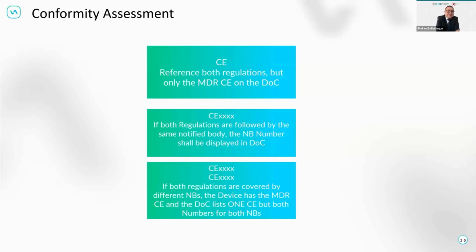Else you will run into the duplicated CE, which will not be possible, because with that one you are not able to get a free sale certificate, because it's currently just not doable. It's technically not doable to get a free sale certificate for your product with 2 different CE marks, and it's also not possible to register the product with 2 different CE marks.